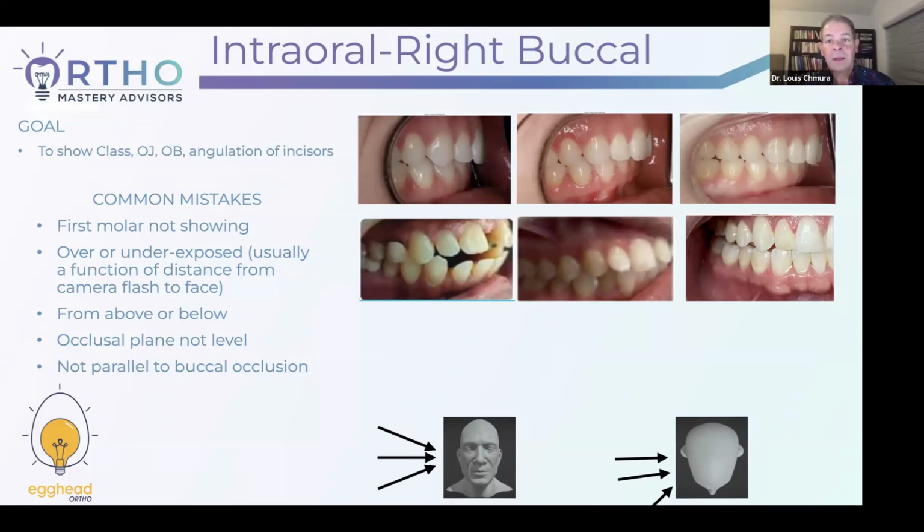Okay. Now I need a natural smile. Can you give me a good smile? And they do it. And I say, oh my goodness, really? That's your best smile? We're going to have to send you to class on that one. And get the natural smile. Take that one. On intraorals, what I would do is I would first take the frontal one.